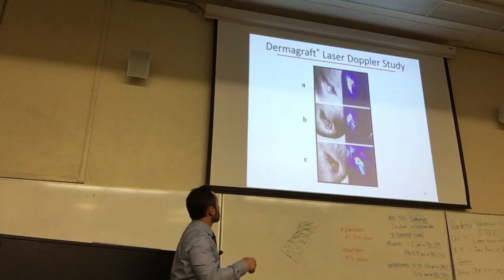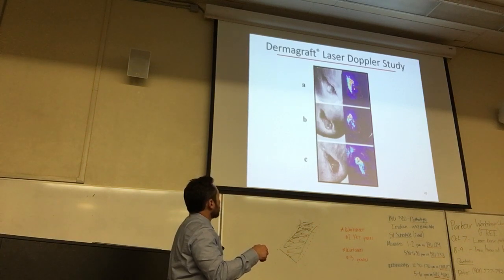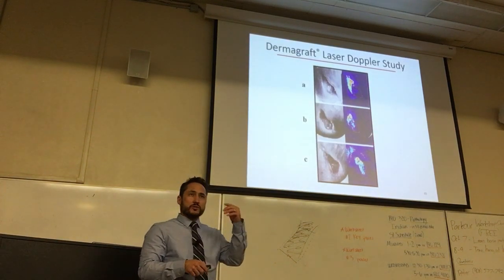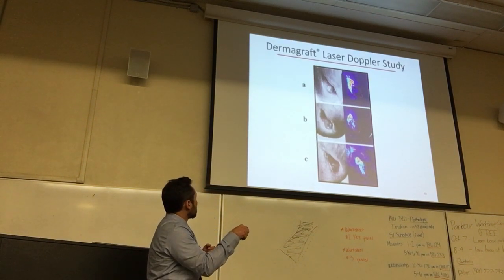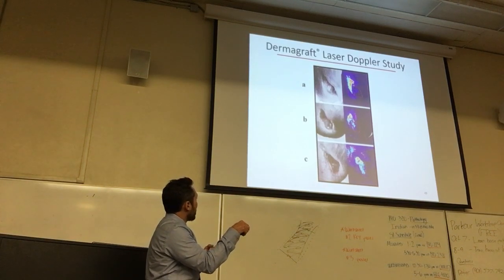And it outputs areas that are light colored, like blue and black, or the light blue, are going to be areas of low blood flow. And the brighter colors, like the reds and the yellows, are indicative of high blood flow. So you can see after, this is at baseline, and this is at 10 weeks, and this is at week 5.